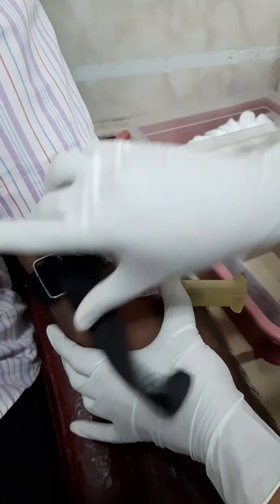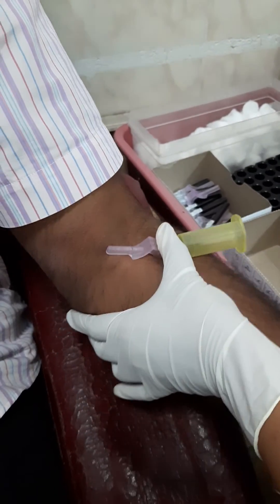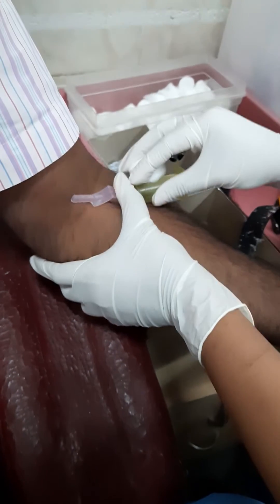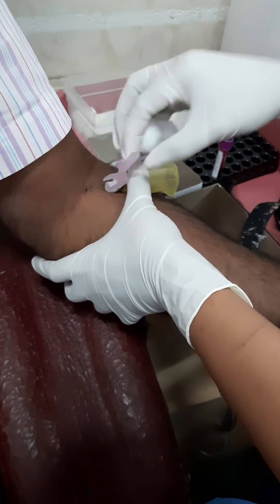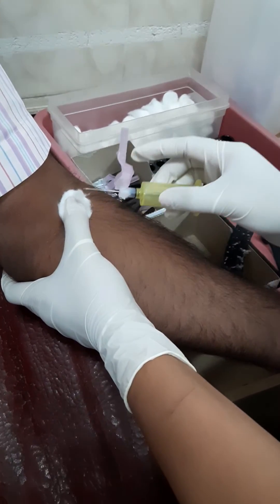Then we will remove this one first. Then we will tell the patient to loosen her hand. Then we will take a cotton, trace it, and remove it.